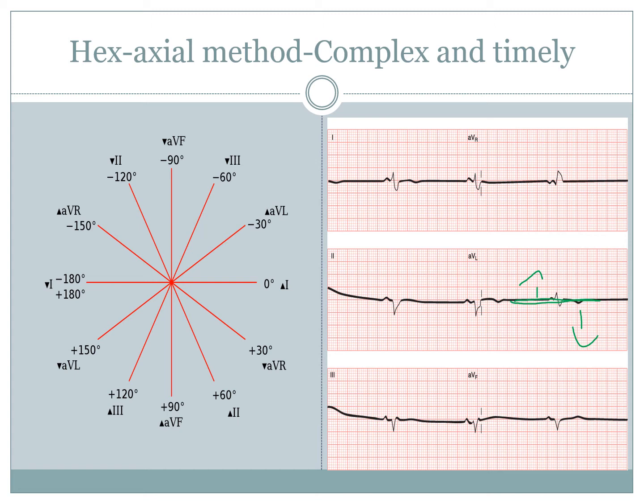From there, you turn the hexaxial diagram in front of you 90 degrees, and you look at the lead that is perpendicular, so the one that's sitting at 90 degrees to the lead that you found. Then you focus on that lead, and you determine whether or not that lead is predominantly positive using the same method, counting positive squares up, taking away negative squares. So is it more positive or more negative? Then from there you'll know which degree it is sitting at on your actual diagram.